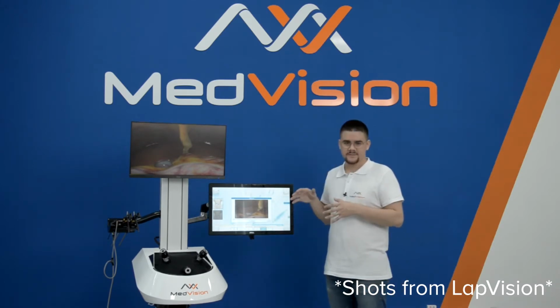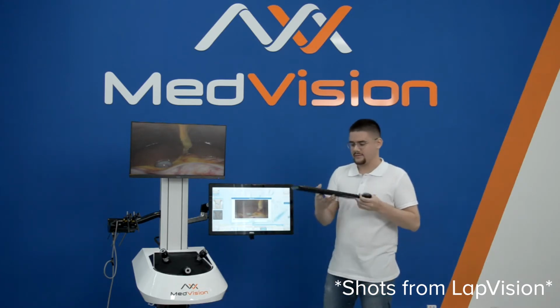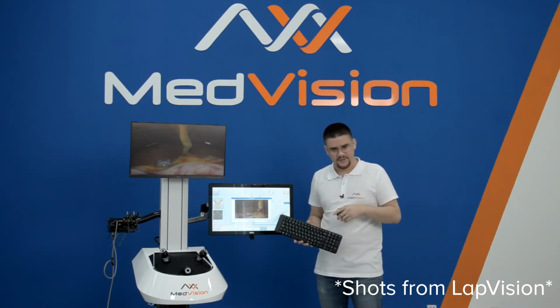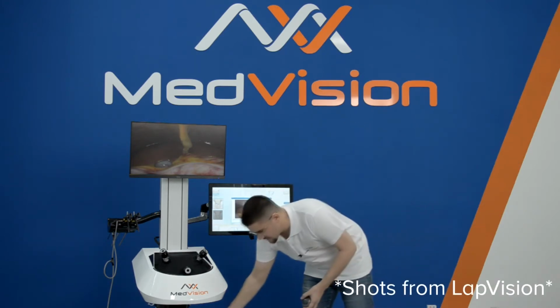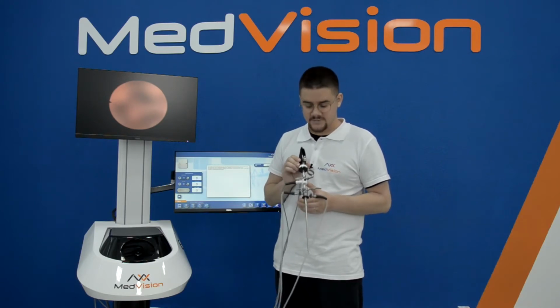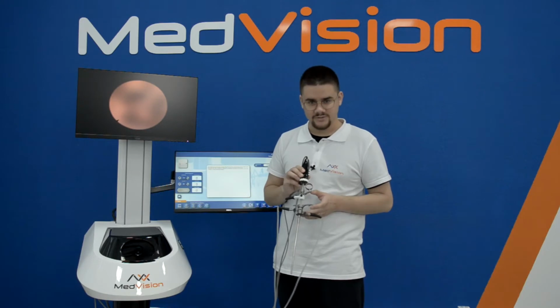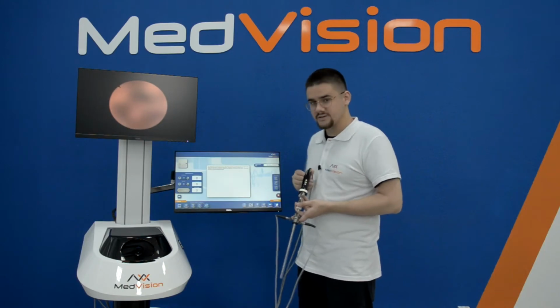Since at the base of a simulator we have a Windows-based PC, you can also operate with more commonly used keyboard and mouse. For example, if you want to close the software and do an update or use the computer to download video files or screenshots, these will come in handy, and they are provided always with our simulators. The differences specific to this simulator are that here we have the special adapted hysteroscope. This part of it is taken from a real instrument, and these are our adaptations for use with the simulator. The other most significant difference would be the touchscreen menu, because it is a little bit different.